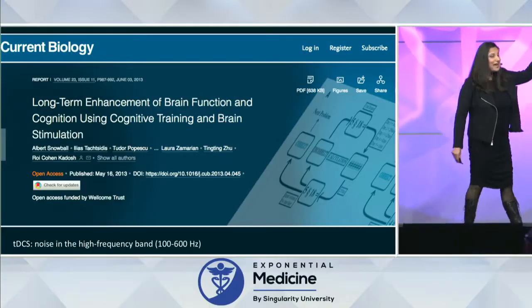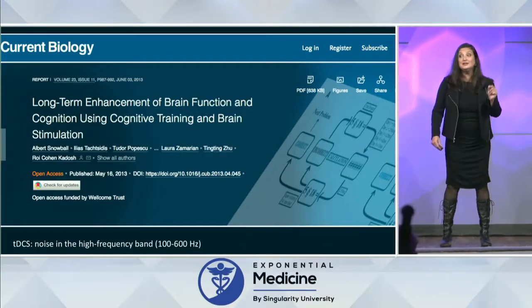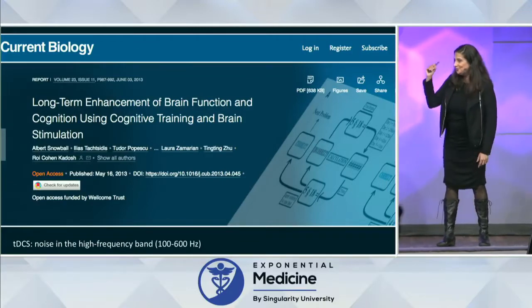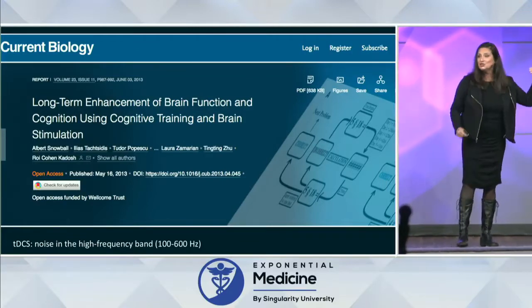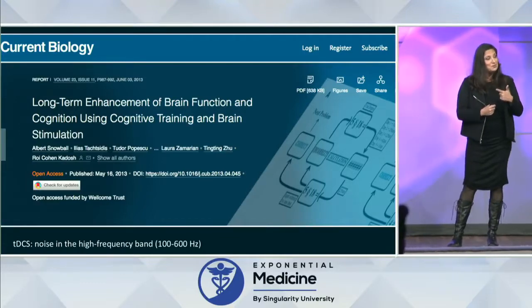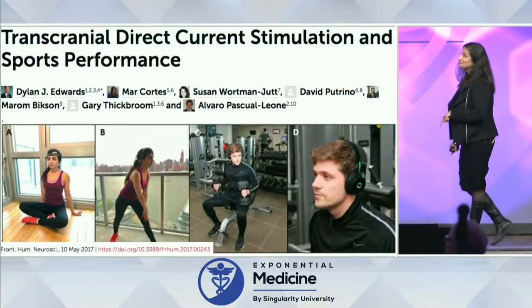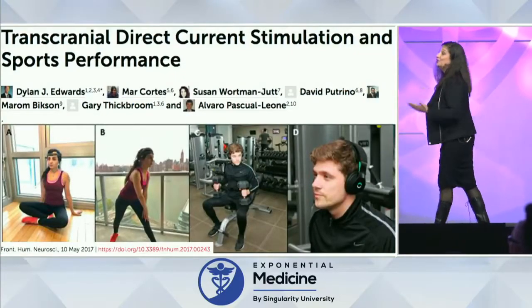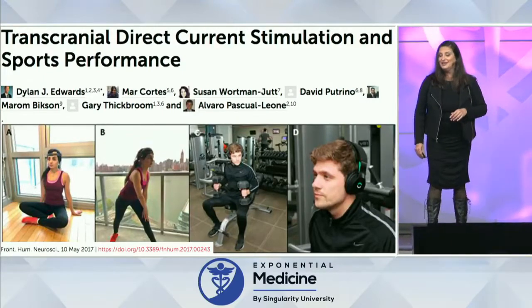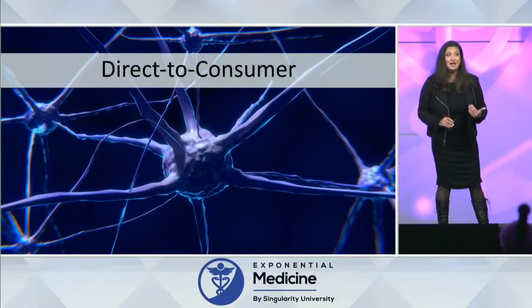So this study actually found that you can use electrical stimulation, and I kid you not, you can deliver random noise outside the brain to the brain, and then have your subjects do an arithmetic task. They not only perform better, but the effects last and persist for up to 6 months afterwards. And transcranial direct current stimulation has been even used to do things like improve sports performance. And why is this important? Because it's created an entire movement.